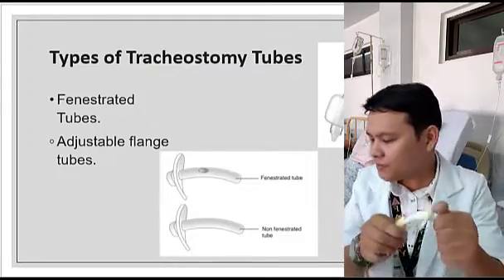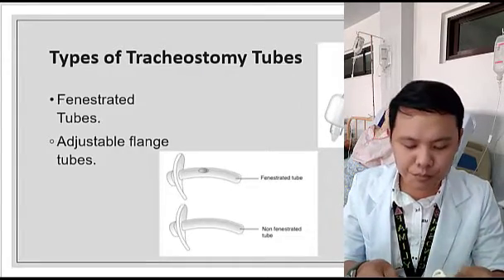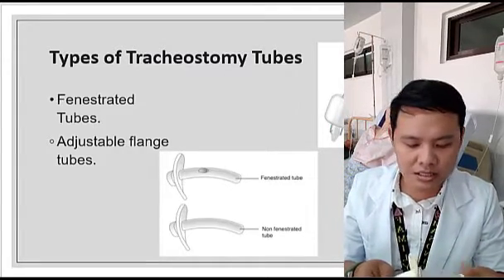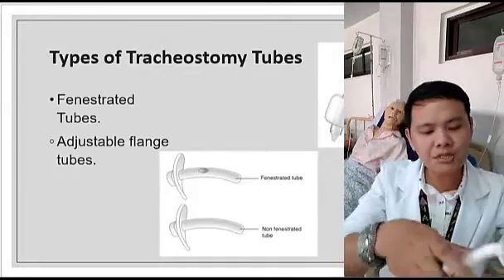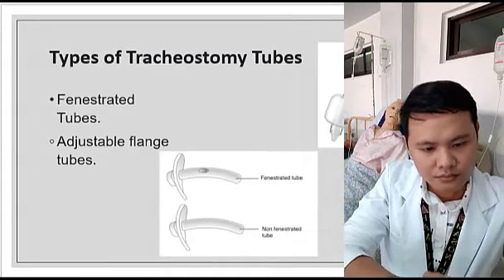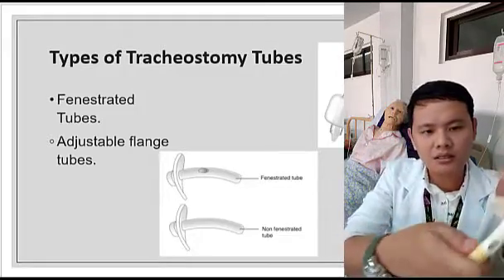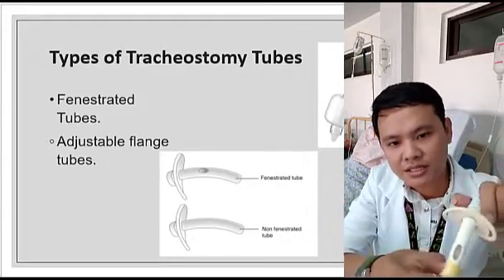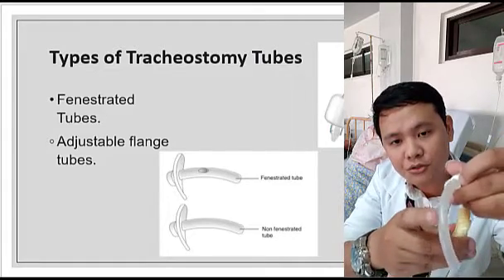Okay, another reason for the fenestrated is that mas maganda siyang gamitin kapag ang pasyente natin is ready na po magsalita. Okay? Yeah. So for this one, I'll just show you something. This is the fenestrated, but as you can see, if I remove the inner tube, wala po itong butas dito. Okay, just wanted to show you something.